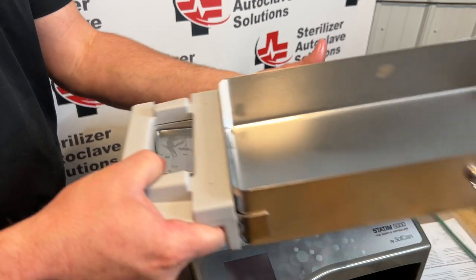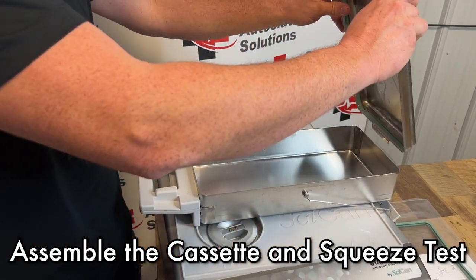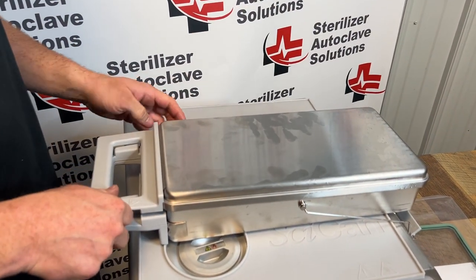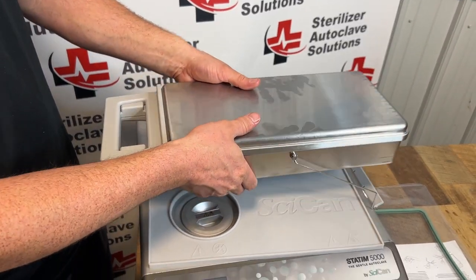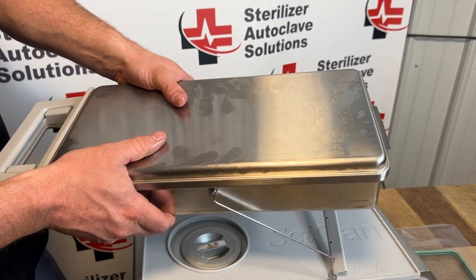Last thing we're going to do is put the top back on the bottom. You can wipe this out — we use stat dry to help get rid of that oil. Push this together and you should hear a squishing sound coming from the back of the cassette.